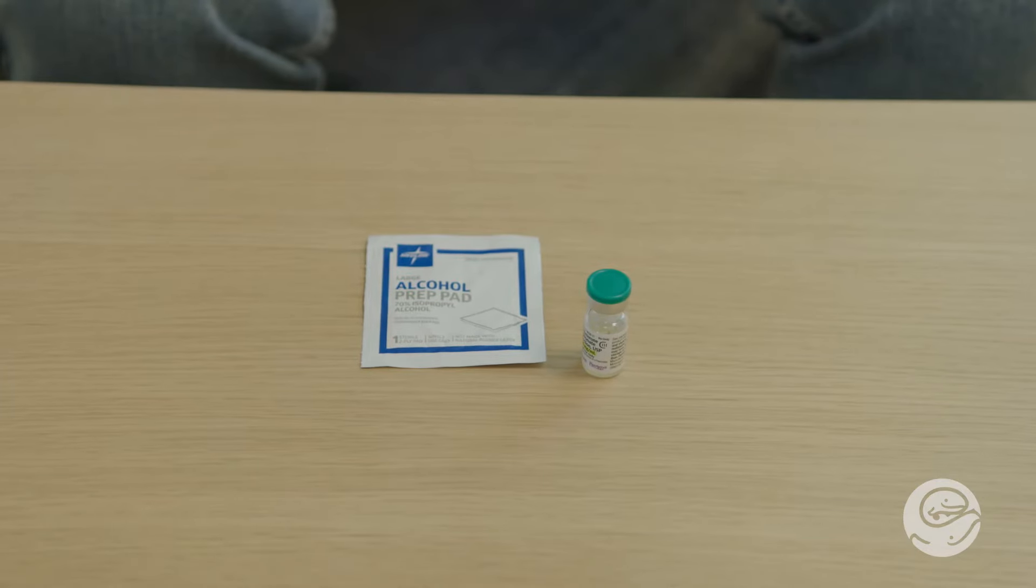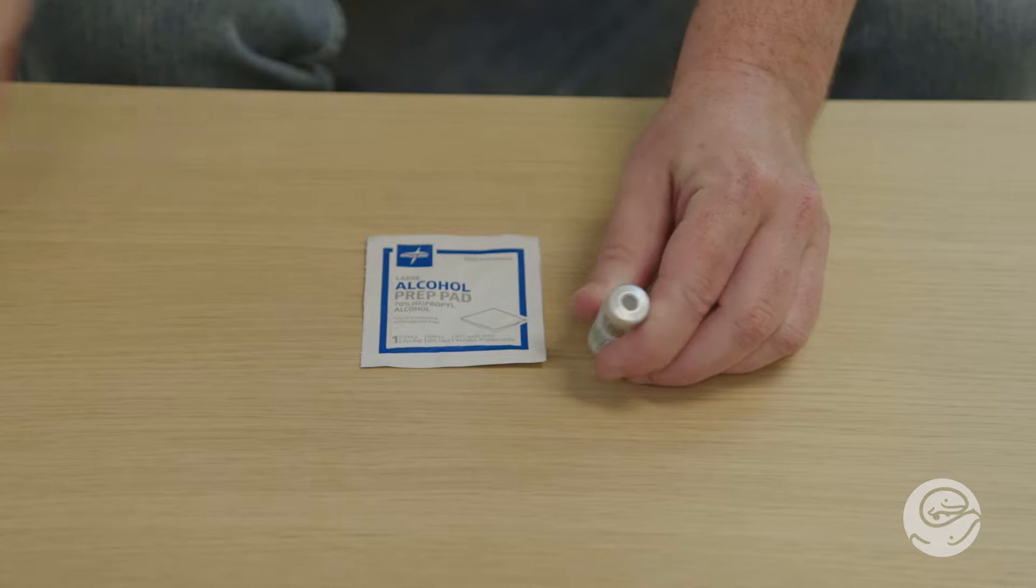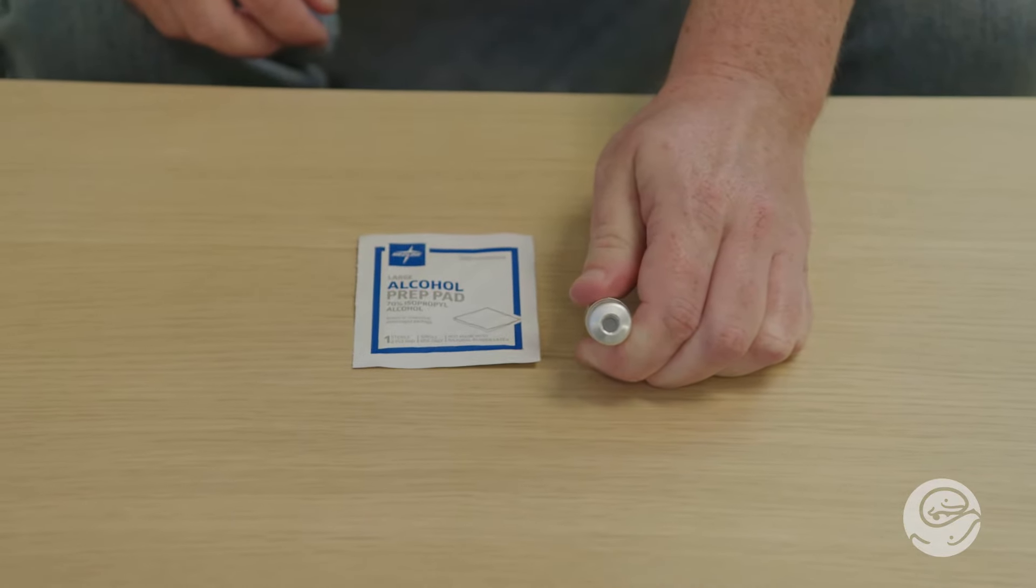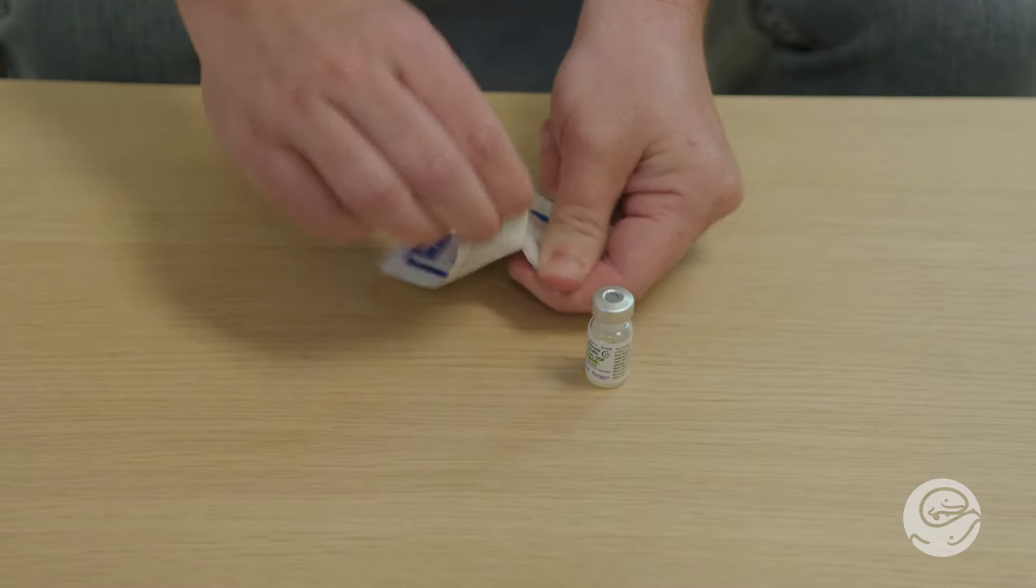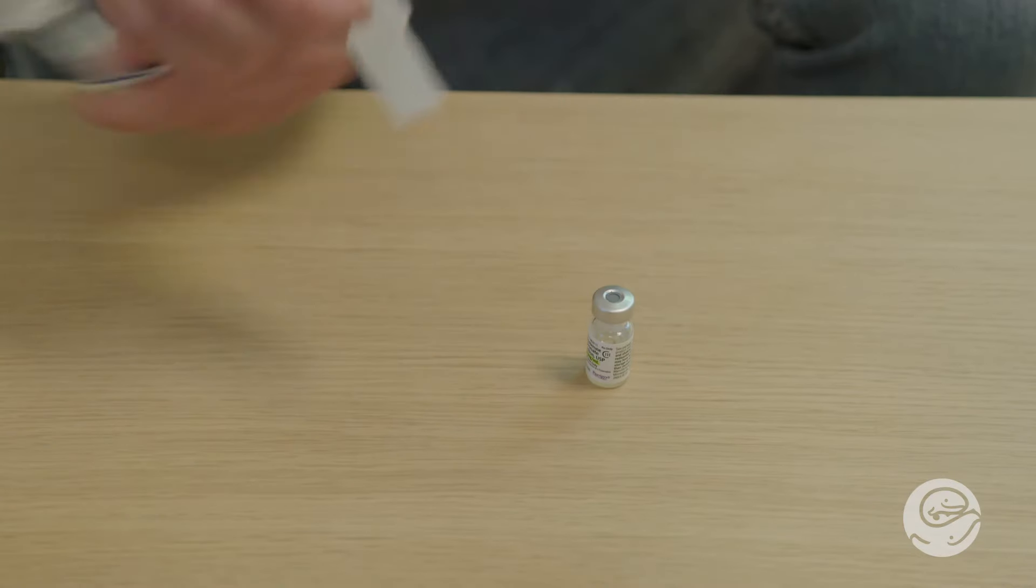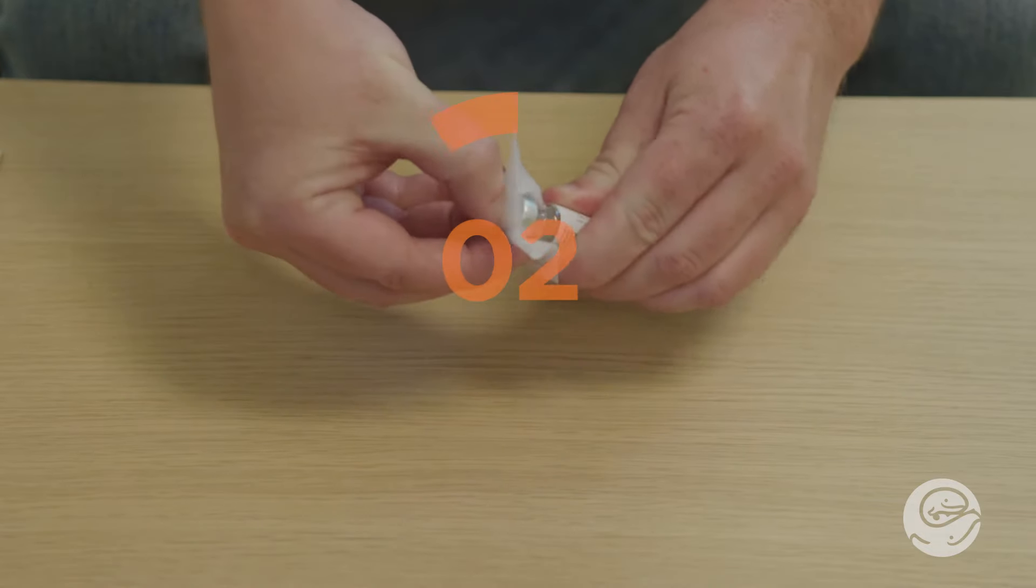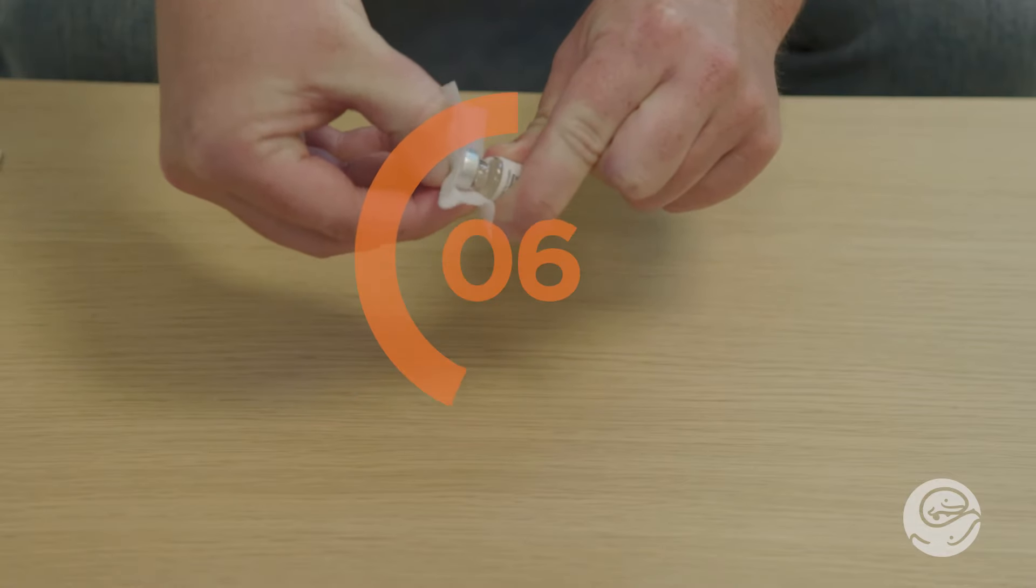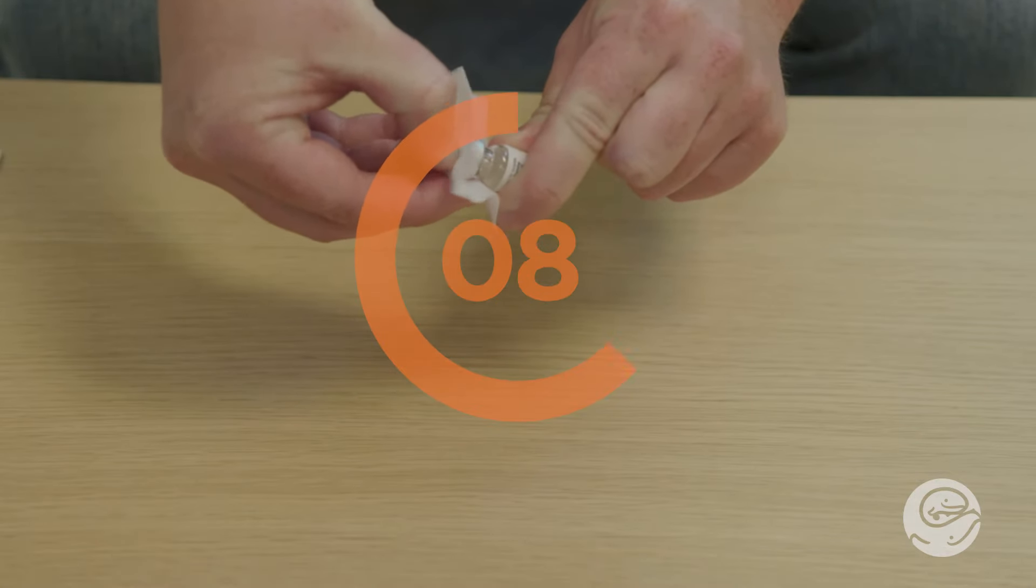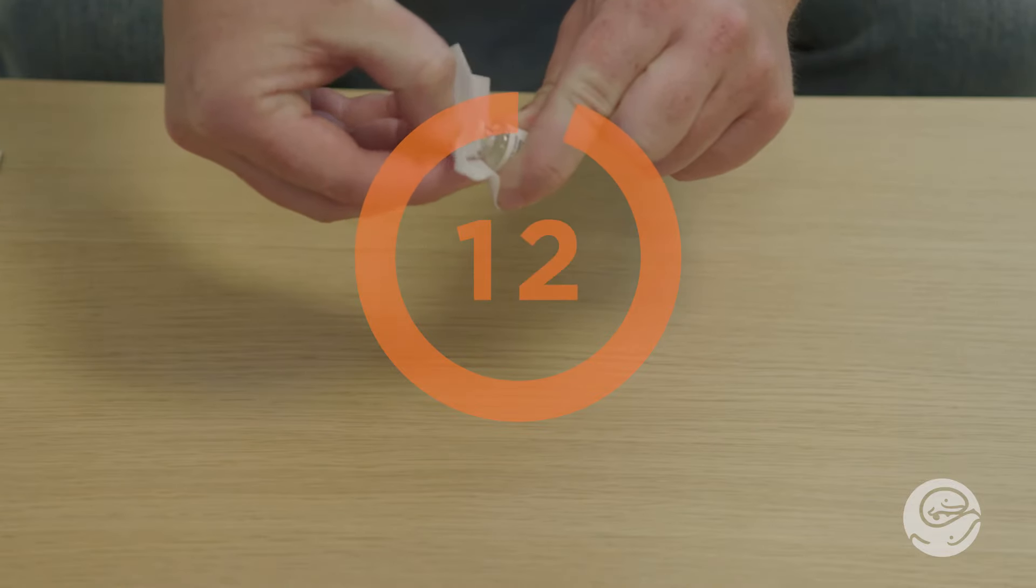If your vial is new, remove the plastic cap from the top. The cap does not go back on. Using an alcohol wipe, clean the top of your vial for 15 seconds. Then, let it dry for 15 seconds. This is also part of the cleaning process.